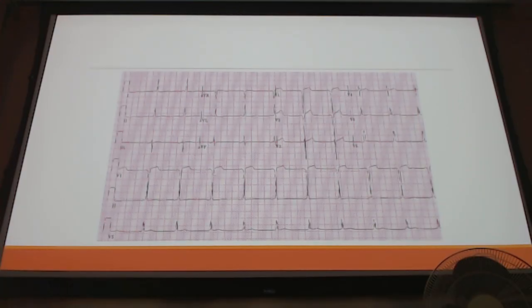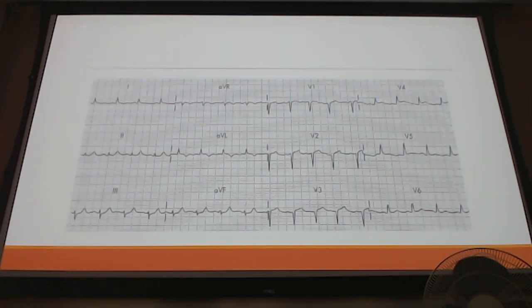You guys see like anterior septal. So this is concerning for which artery? The LAD. Yeah, the LAD, so the left anterior descending. Yeah, good. What about, do we see reciprocal changes on here? Yeah, I don't really see anything on there. Good, what about this one?